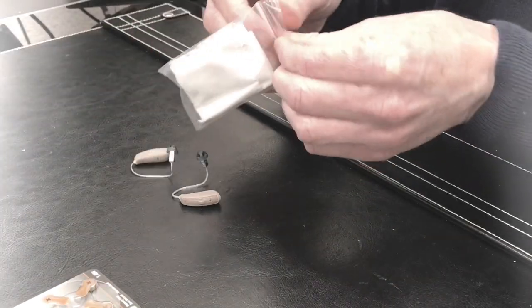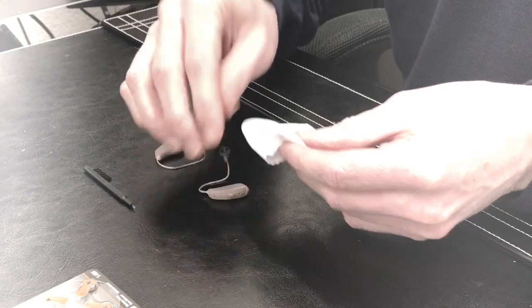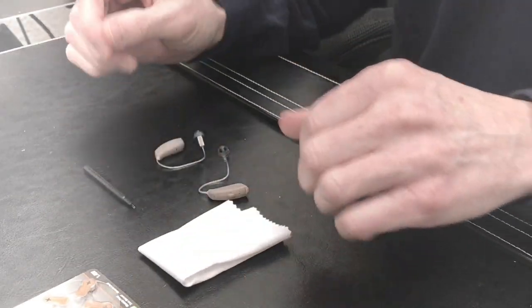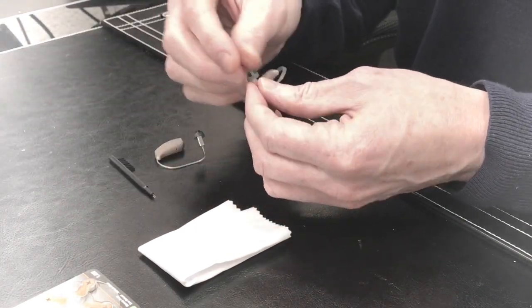So, with your hearing aid, you should have gotten a little cleaning packet, which contains a brush and a cloth. Basic cleaning.